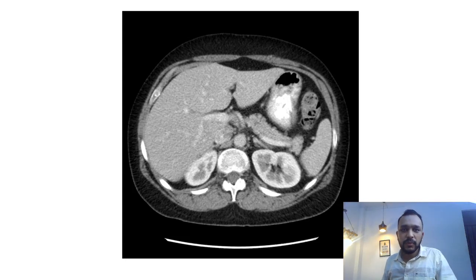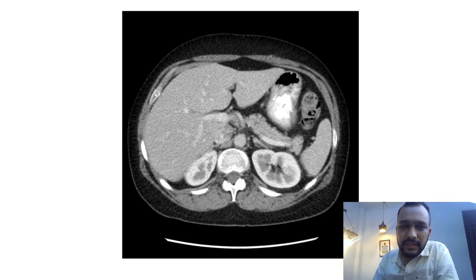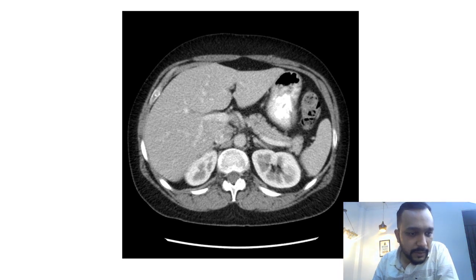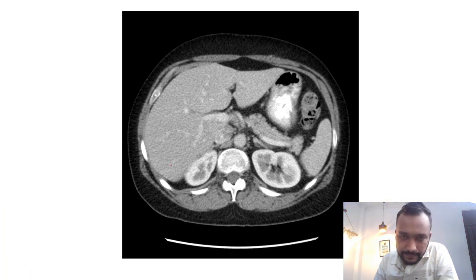This is video number two. I hope you have seen the previous video in which I discussed about the triple phase CT abdomen. Now I'm going to tell you about the normal CT anatomy of the abdomen.